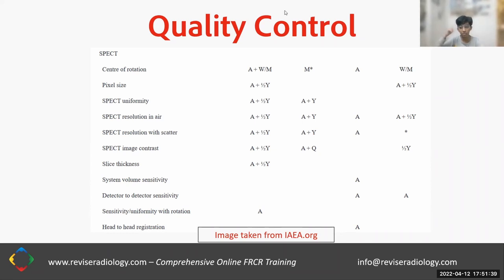The way that these things will go out of order depends on what the equipment is made of, like the mechanical motion itself. As we know, with mechanical motion there are all kinds of things like friction, etc., which are going to throw the calibration off. The electronic system needs to be constantly calibrated to the equipment, etc. So if we are aware of how often these things go out of order, then we are able to draw up a proper quality control plan.